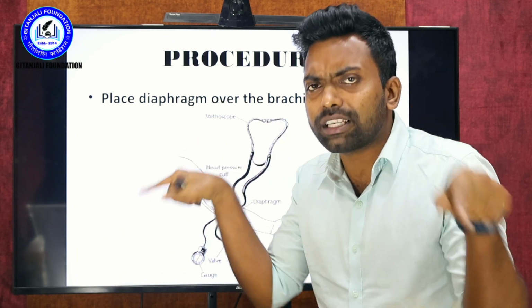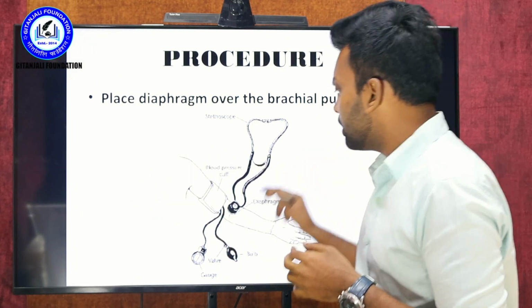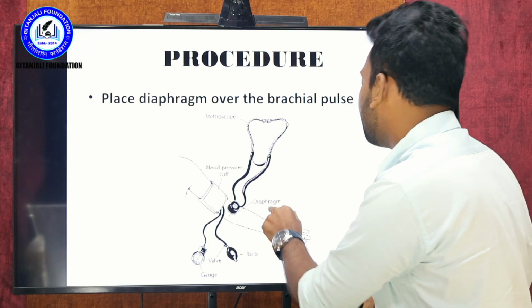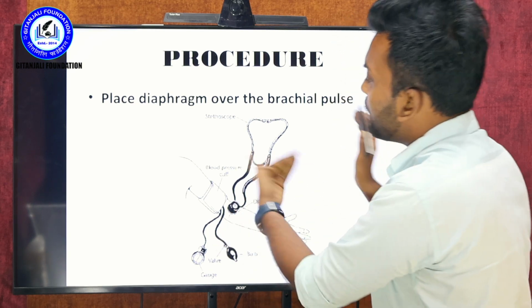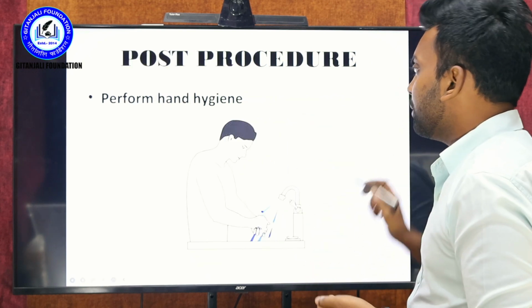So depending on the sides of the arteries, we differentiate between the two kinds of things. So this is how you're going to feel it. The same way you felt the pulsation using the manual method, you will get the same kind of sound by using this auscultation method.